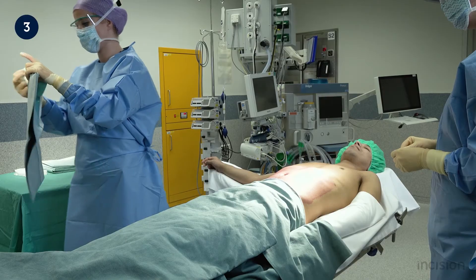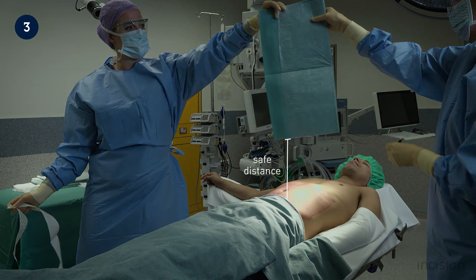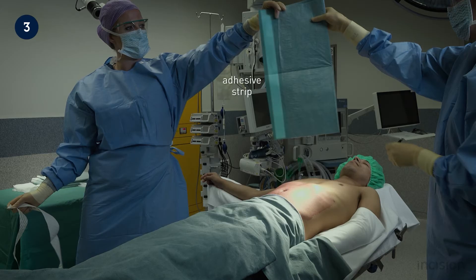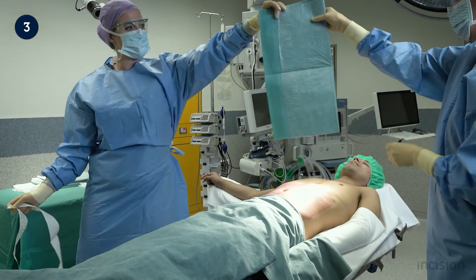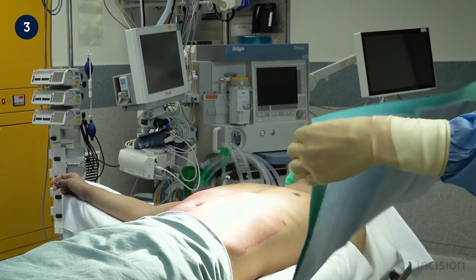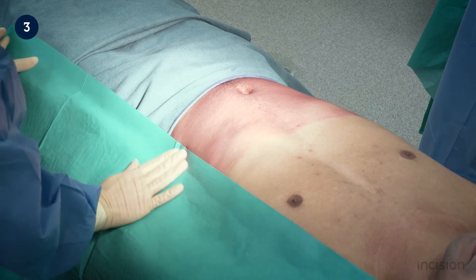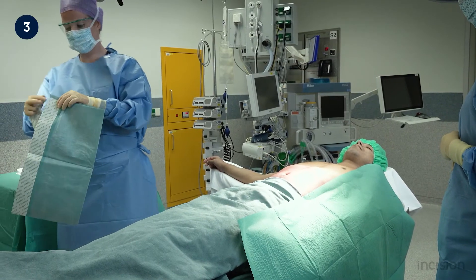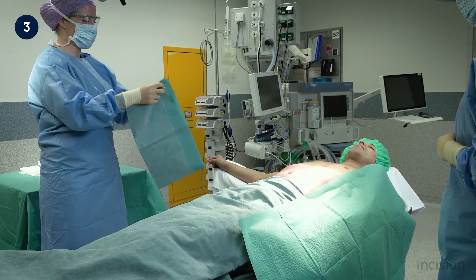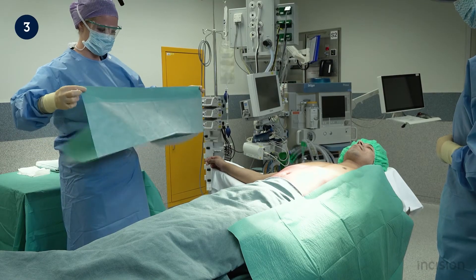A safe distance is maintained, the drape unfolded, and the adhesive part uncovered. The drape is handed over above the table. Take note of the distance between the drape and the unsterile area below, and of how both OR team members try to minimise contact with the adhesive strip of the drape. The single drape is unfolded by the surgeon on their own. Once unfolded, it is applied to the patient's side. Take note of how the surgeon maintains a fold at the edge of the drape to avoid touching the patient. The scrub nurse then does the same on the opposite side. Unfolding is performed in a manner that avoids contamination, and the scrub nurse waits until the drape is completely unfolded before applying it to the patient's side.